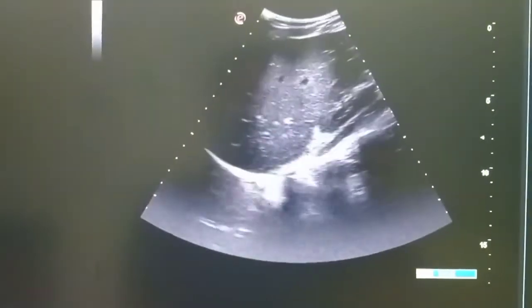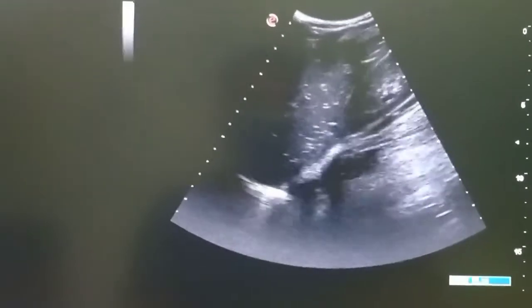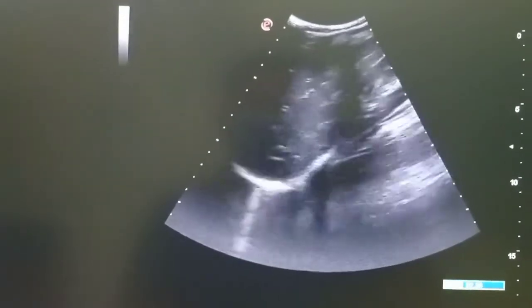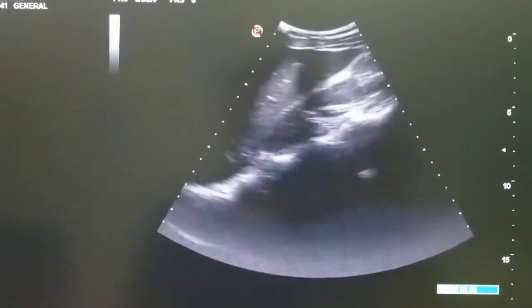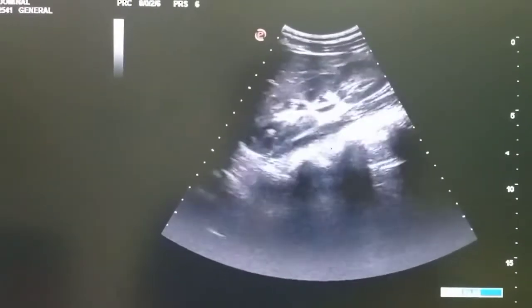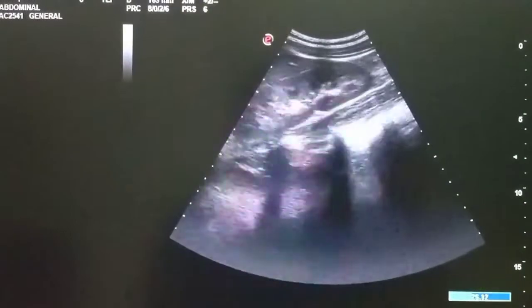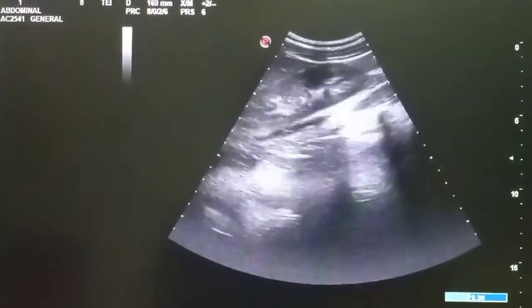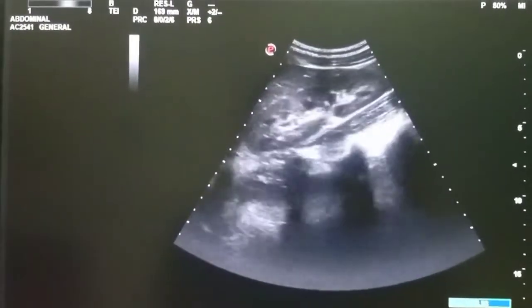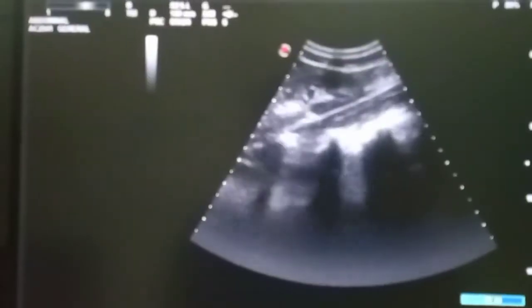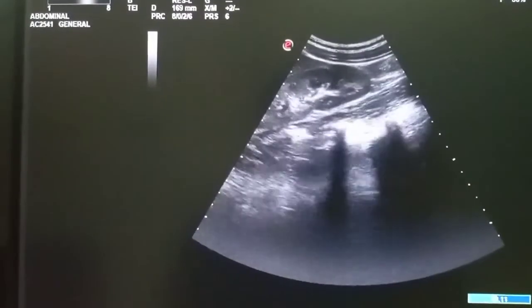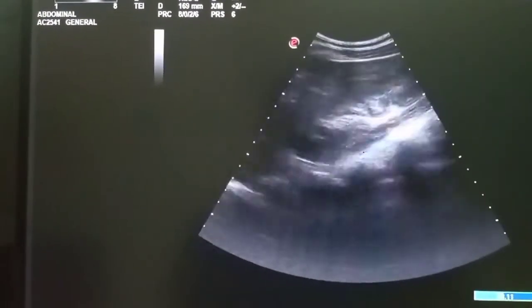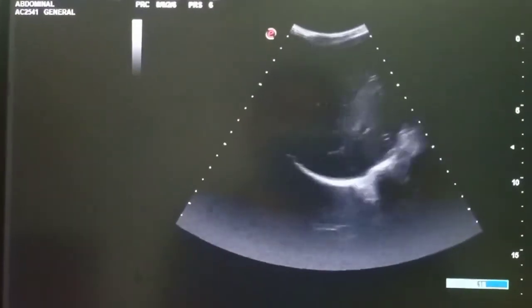In this window you can see that these whitish spots are showing the raised periportal echogenicity of the liver. Along with the liver, I am scanning the kidney region — you can see the kidney looks normal.